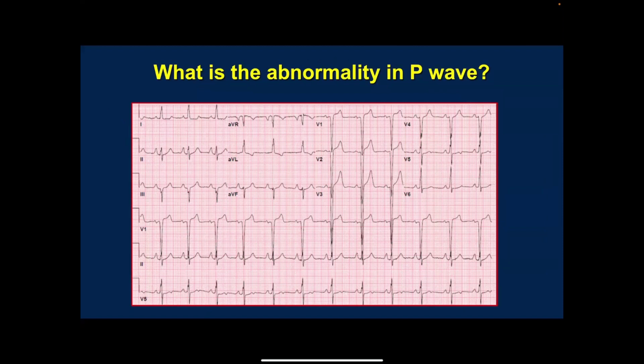Okay, what about here? Right atrium. Yes, do you see how big these P waves are? So this is right atrial enlargement.